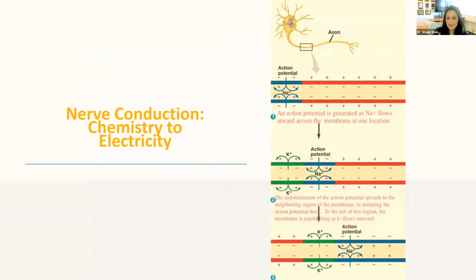It doesn't allow the cell to say, hey, let's fire. It blocks that opportunity for the nerve. And so that's the mechanism by which it works.